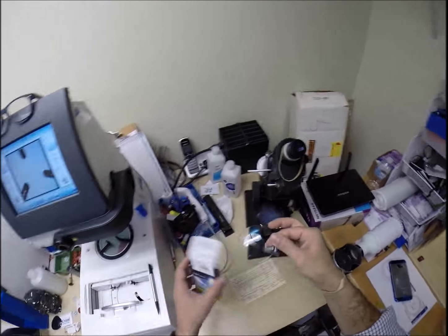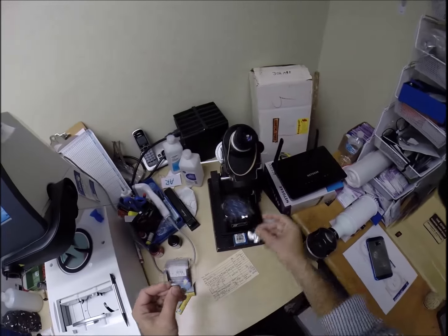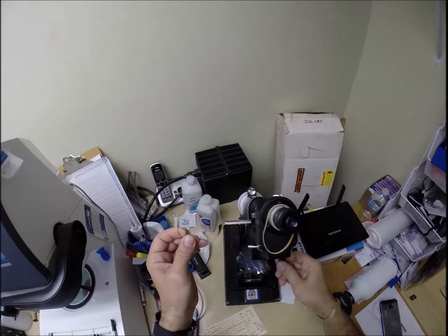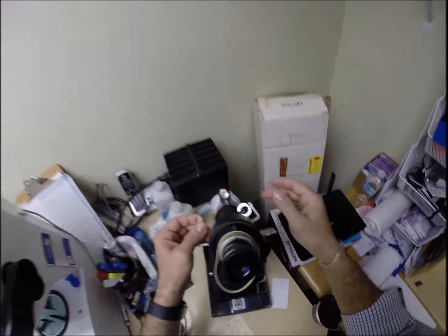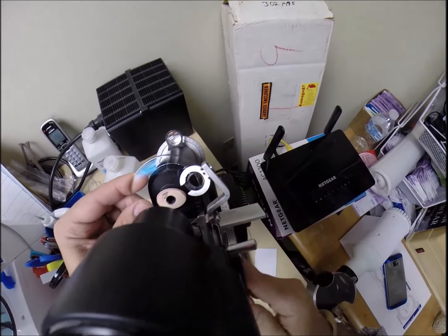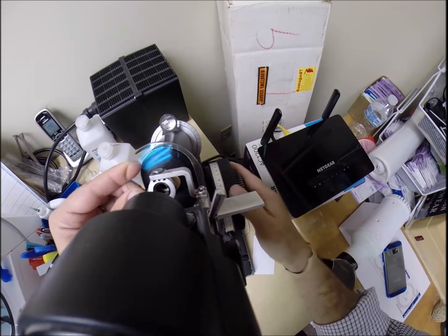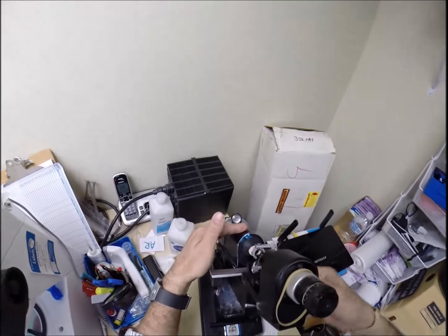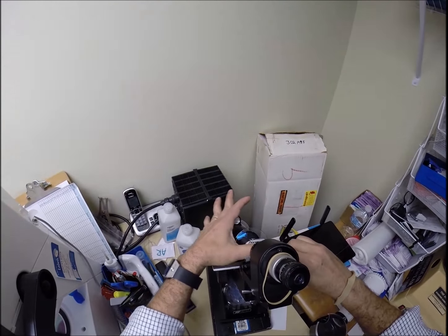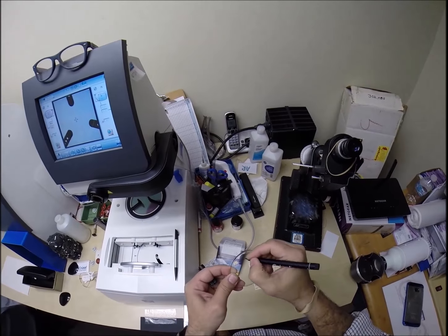Let me go ahead and take the lens out of the protective sleeve. It comes with a little laminate on the front of the lens to protect the lens from something rubbing on it during shipping. Of course, I'm going to put the power drum on +1/4. Rotate the lens until the spherical component comes in clearly. Check the astigmatism correction, which I'll explain in just a little bit. Then I'm going to put 3 dots on the lenses. And one of them never wants to show up, so I'm going to put that over there. And this is the right lens.